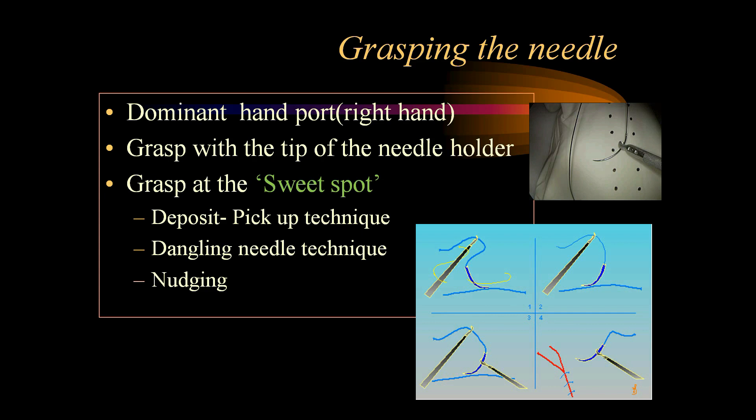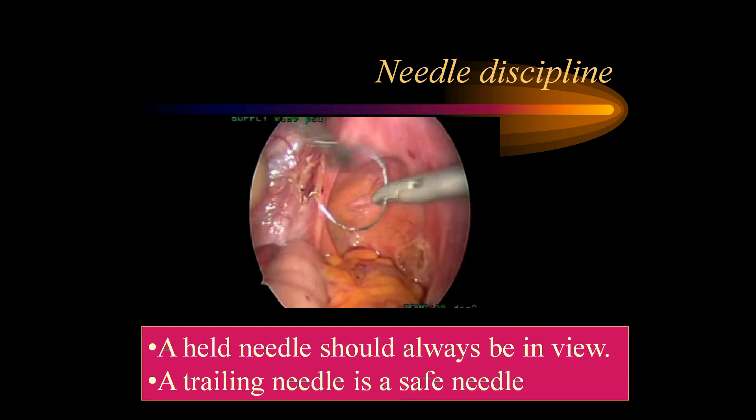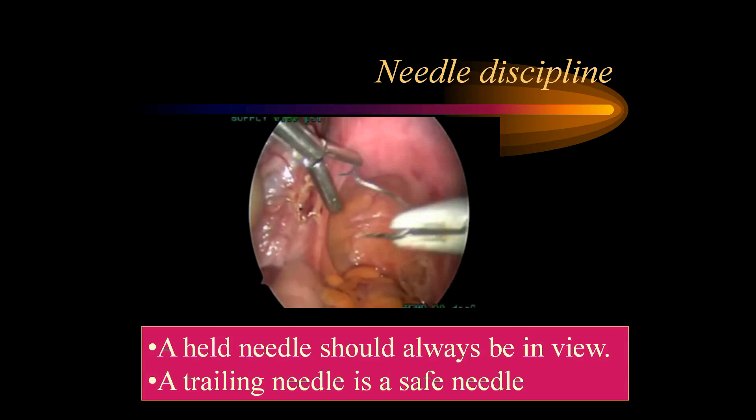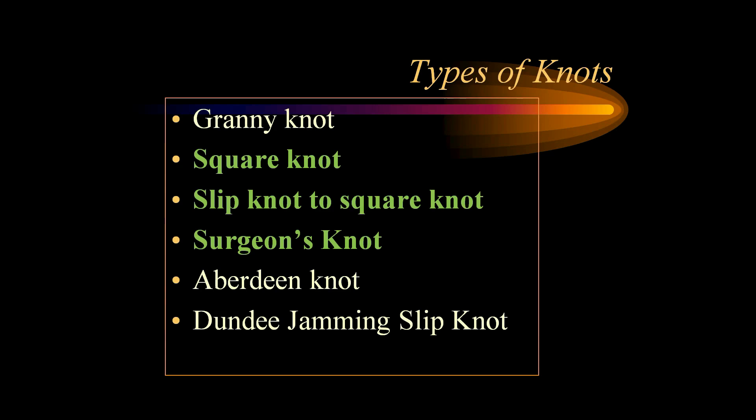As shown in this video, the needle is dangling and held — and the needle should always be in view. A trailing needle is safe, whereas a held needle can cause injury, so it should always be under view, and the camera person should be very well aware of this needle principle. There are various types of knots one should practice: square knot, slip knot changing into square knot, surgeon's knot, and occasionally Aberdeen knot and Dundee jamming slip knot.